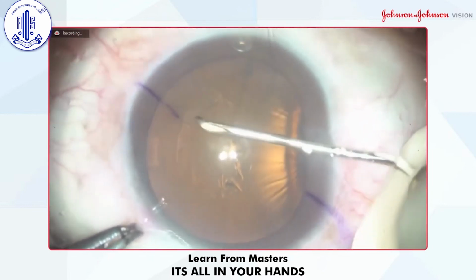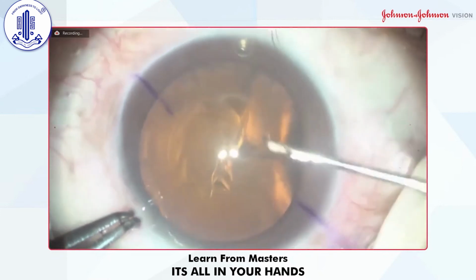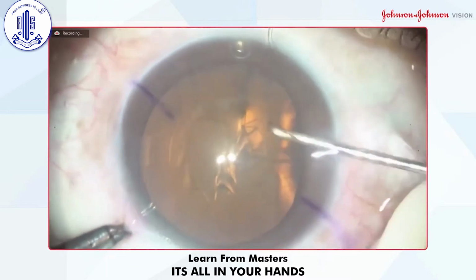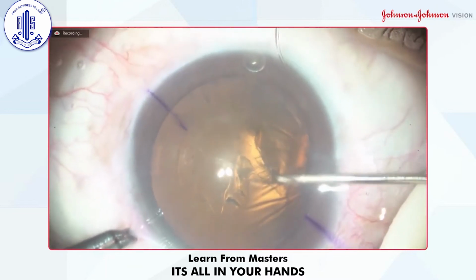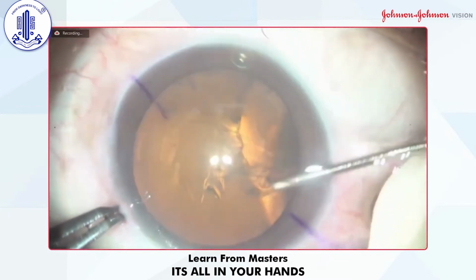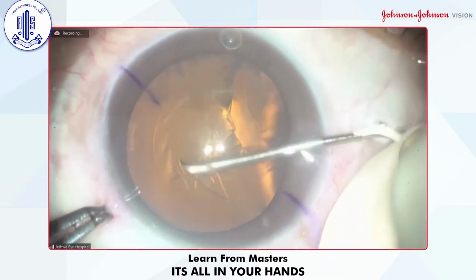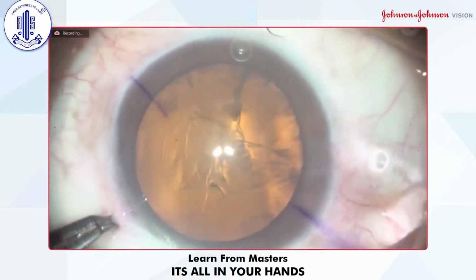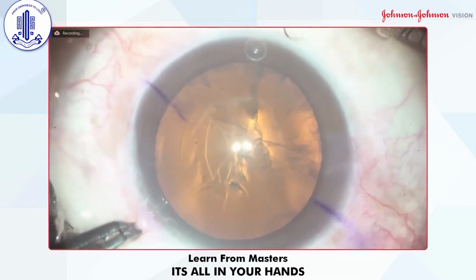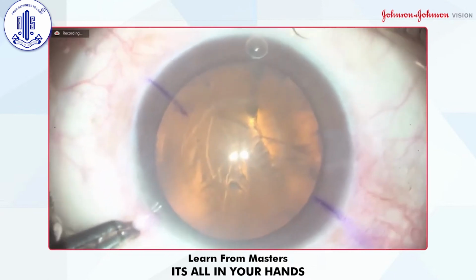If the pupil is regular, try to follow the... Hilon is softer than viscoat. So here it is a 2.4 incision I am putting at 135.